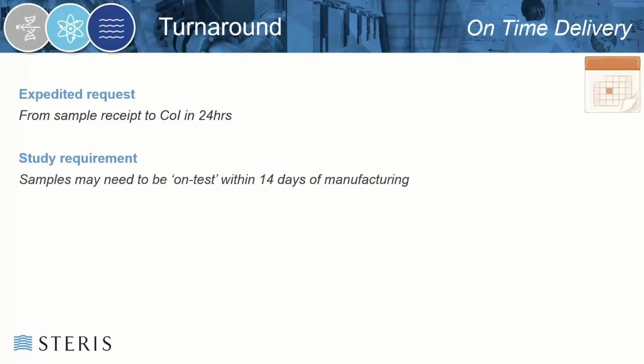And the reason that is in there is, if you think about it, if you're doing bioburden testing and you're doing a microbiological test, the dose audit obviously is trying to establish that the actual routine process is working. So if the timings don't match, and then the bioburden is changing over that time, either decreasing or increasing, is it actually reflecting it? Is it more of a challenge, or is it less of a challenge? Obviously, the latter probably being more of an issue. So that's really why that's there.